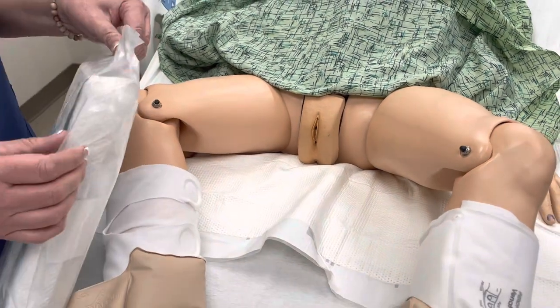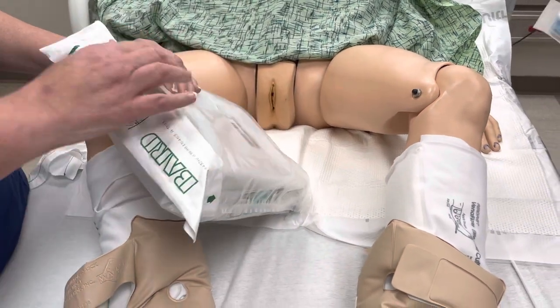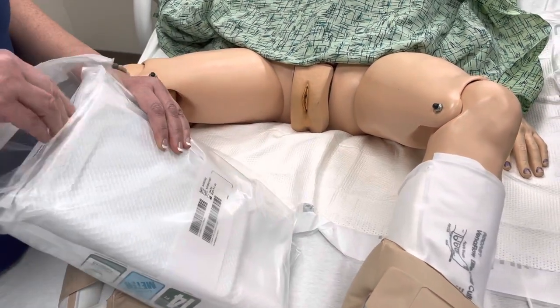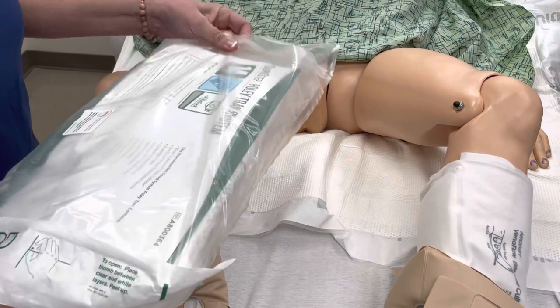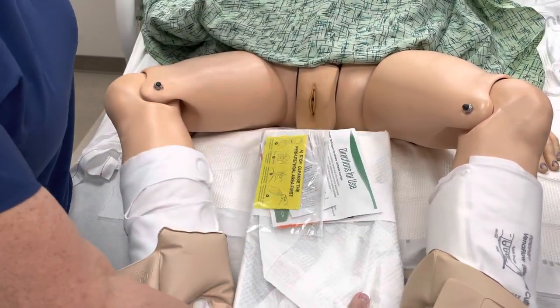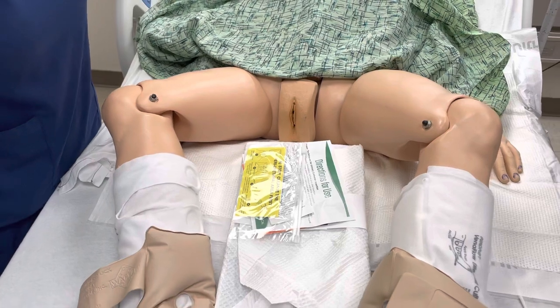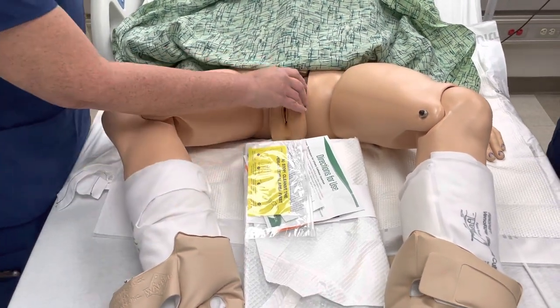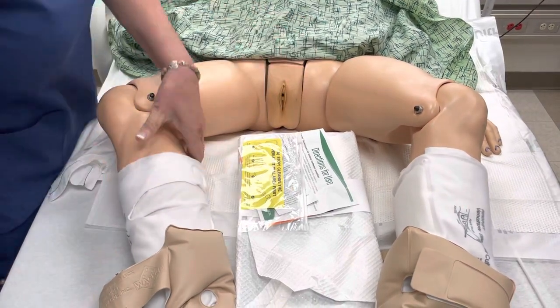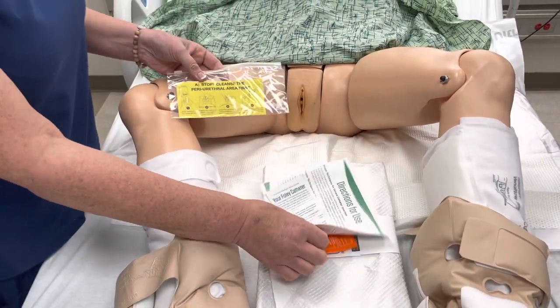You will want to educate your patient about what's going to be going on, get them positioned, and have your second person there at the bedside with you. Typically, we're going to lay the patient flat and then help them to hold their legs up so that we can take as much pressure off their hips as possible. We also want to set up our sterile field on the bed. A lot of people were trained to set it up on a bedside table; however, it causes a lot of opportunity for contaminating your sterile field when you're constantly turning from one area to another. Setting up your sterile field on the bed gives you the best opportunity to not contaminate your sterile area.